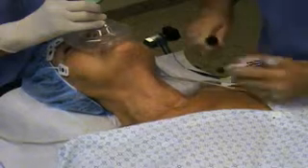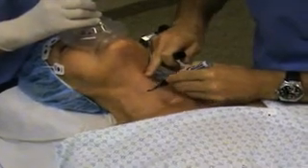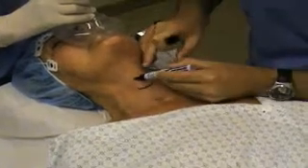Alternatively, you can introduce the anesthesia by direct injection via puncture of the cricothyroid membrane. This direct injection technique is reliable, time efficient, and easy to perform.